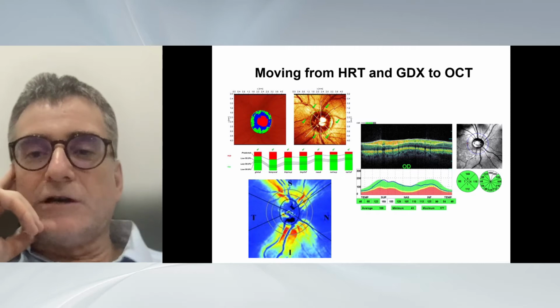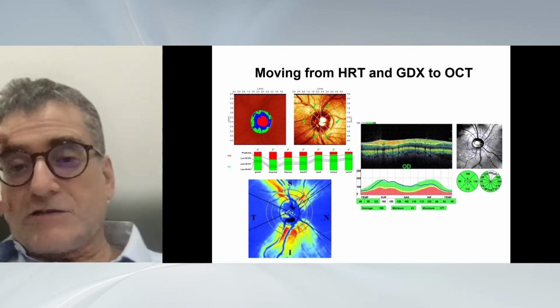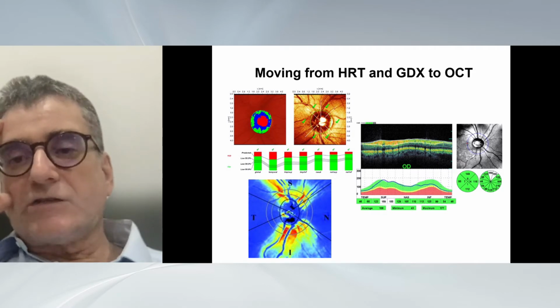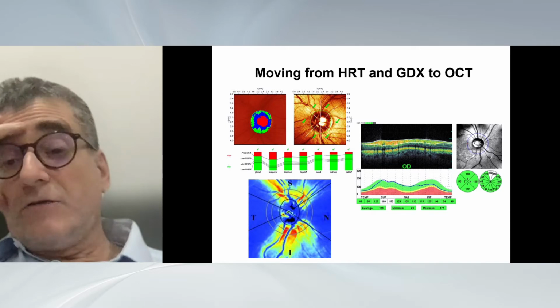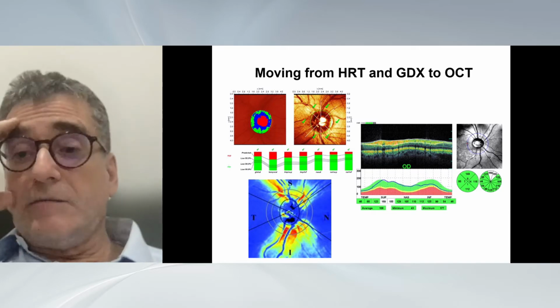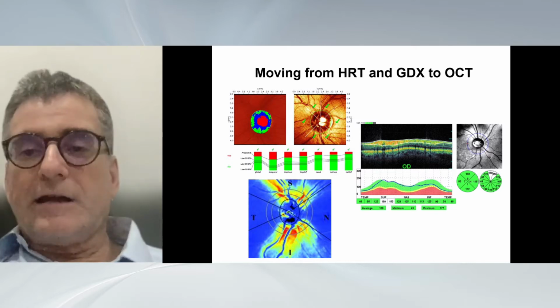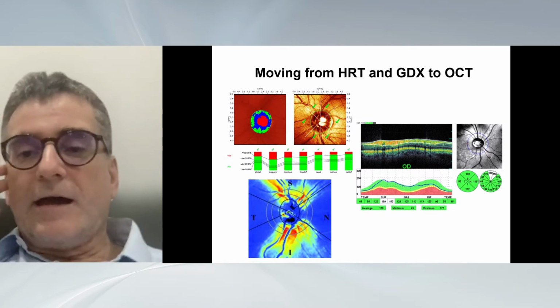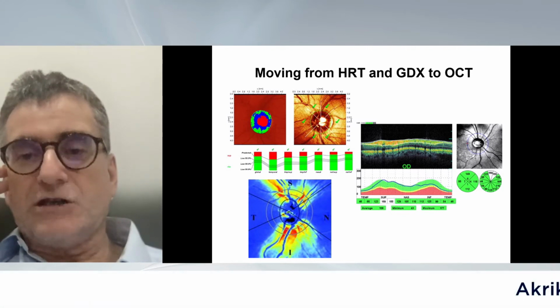25 years ago, we saw a transition from HRT and GDX to OCT. And the reason is that OCT really revolutionized structural imaging in glaucoma, because it provides unprecedented resolution and gives more information than either HRT or GDX.